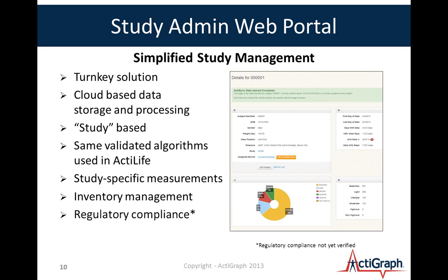And then, we're working now on regulatory compliance with the system to meet some of the needs of our customers. And I'll just mention that our devices, as you know, are FDA compliant. We're working now with the system. Regulatory compliance is just an evolving entity. You never actually achieve the panacea that is perfection there. And so we're working with our customers right now to understand what type of regulatory needs are there so that we're sure to meet those with the system. And we've been blessed with some customers who've allowed us to understand and work through what's needed there. But specifically, some of the CFR regulations, we're working through some of those today.